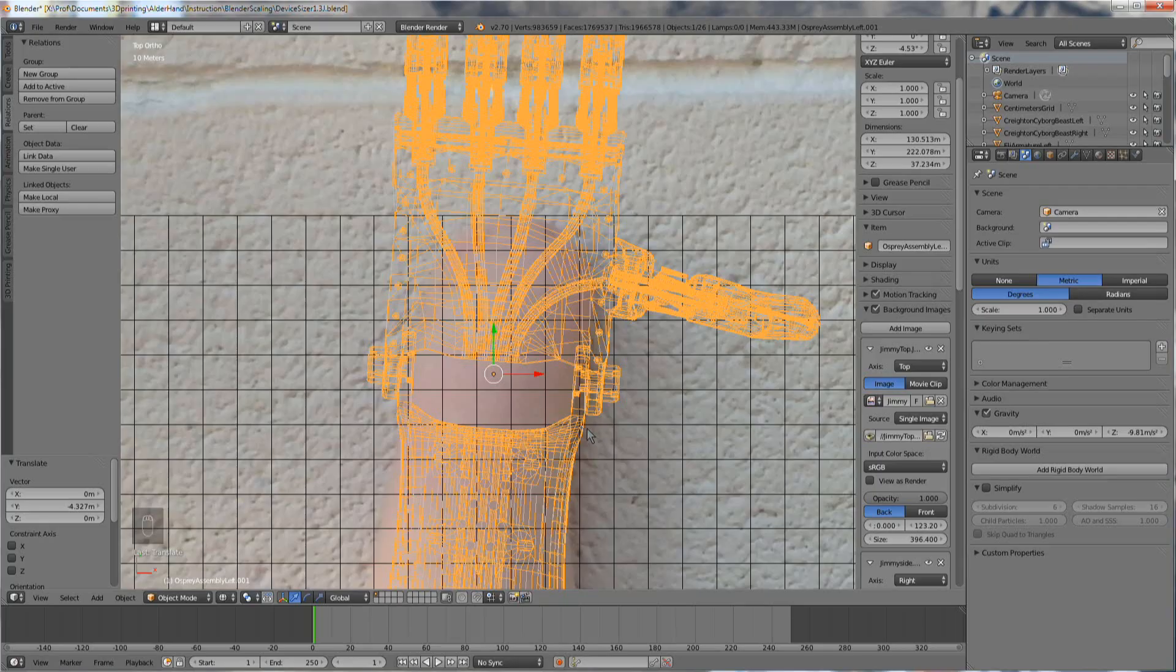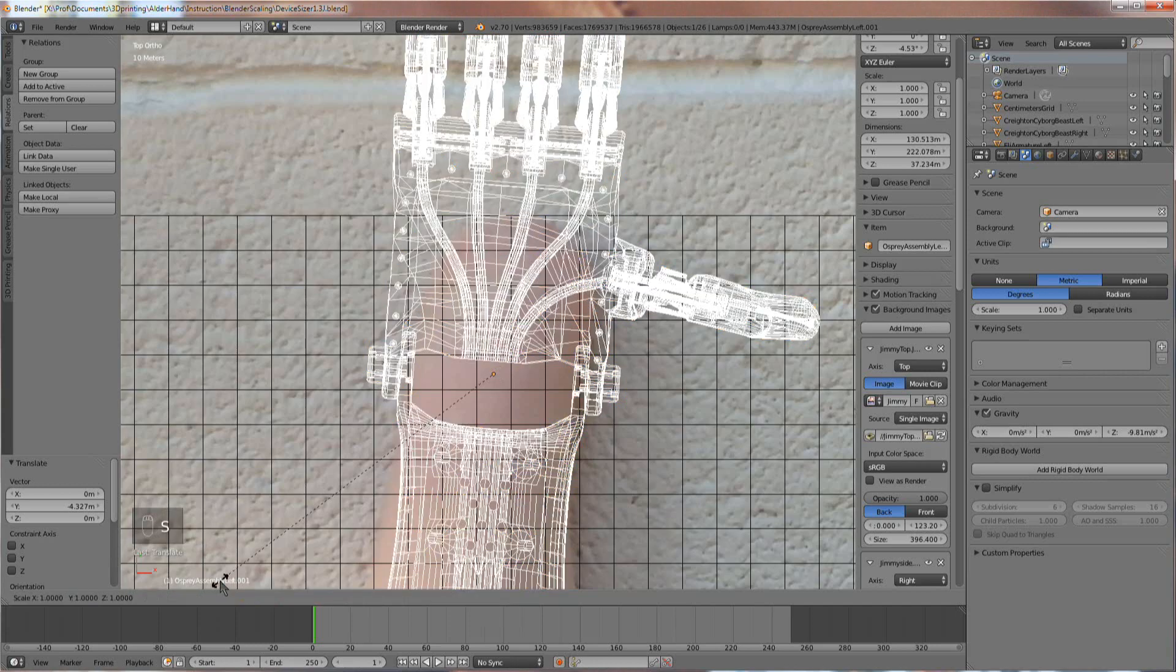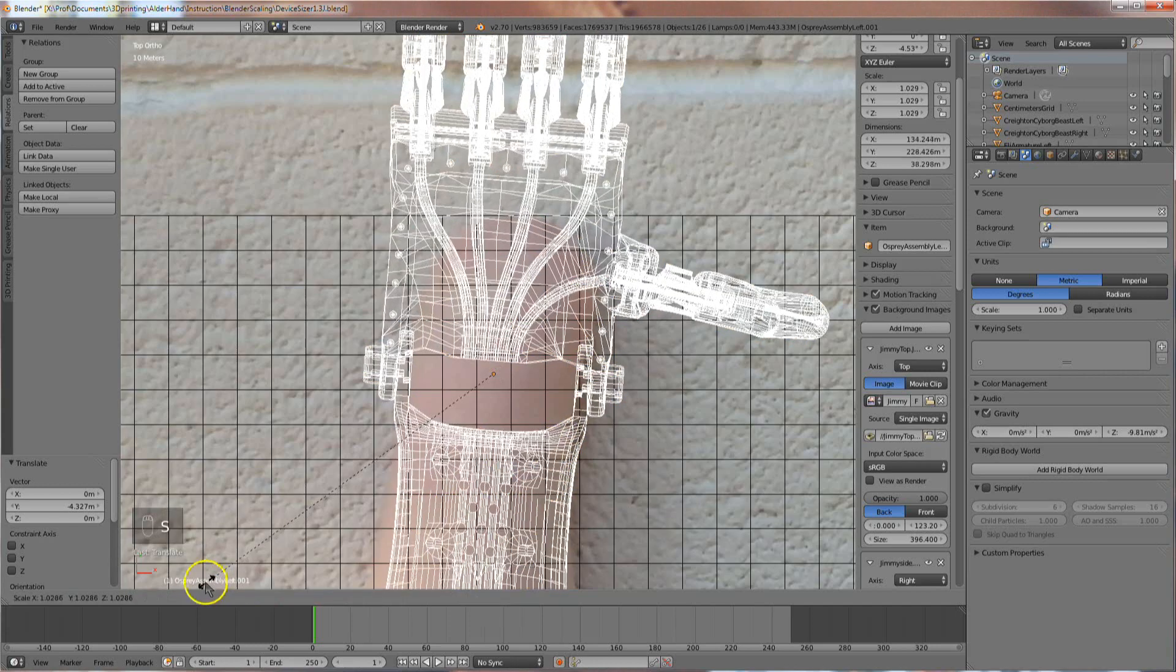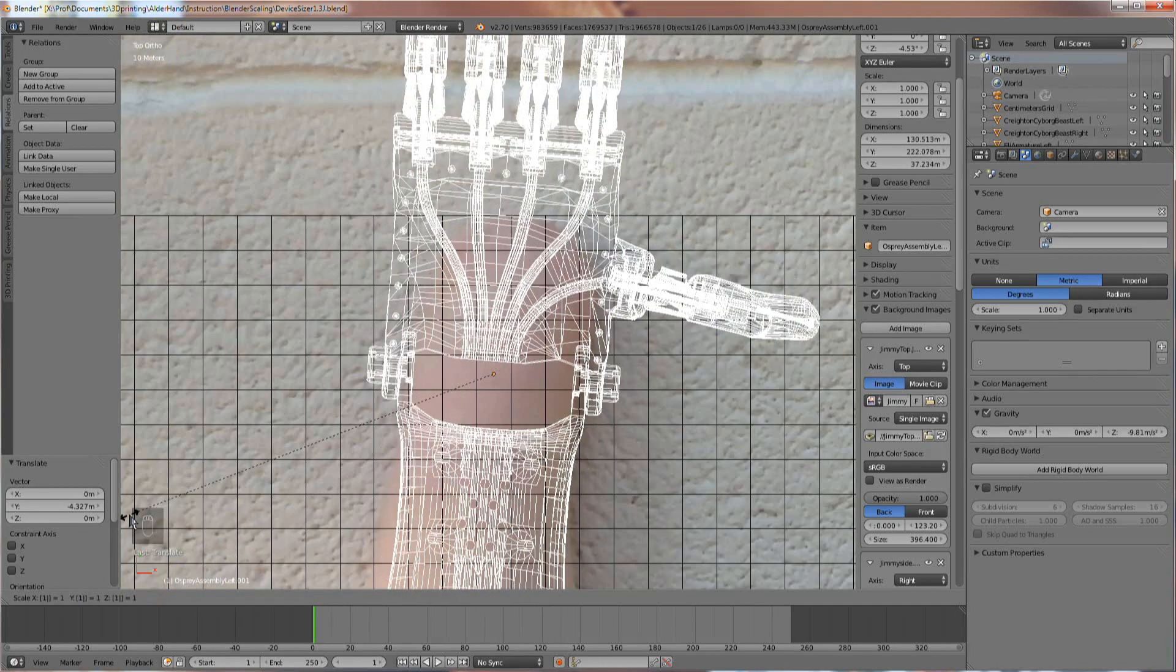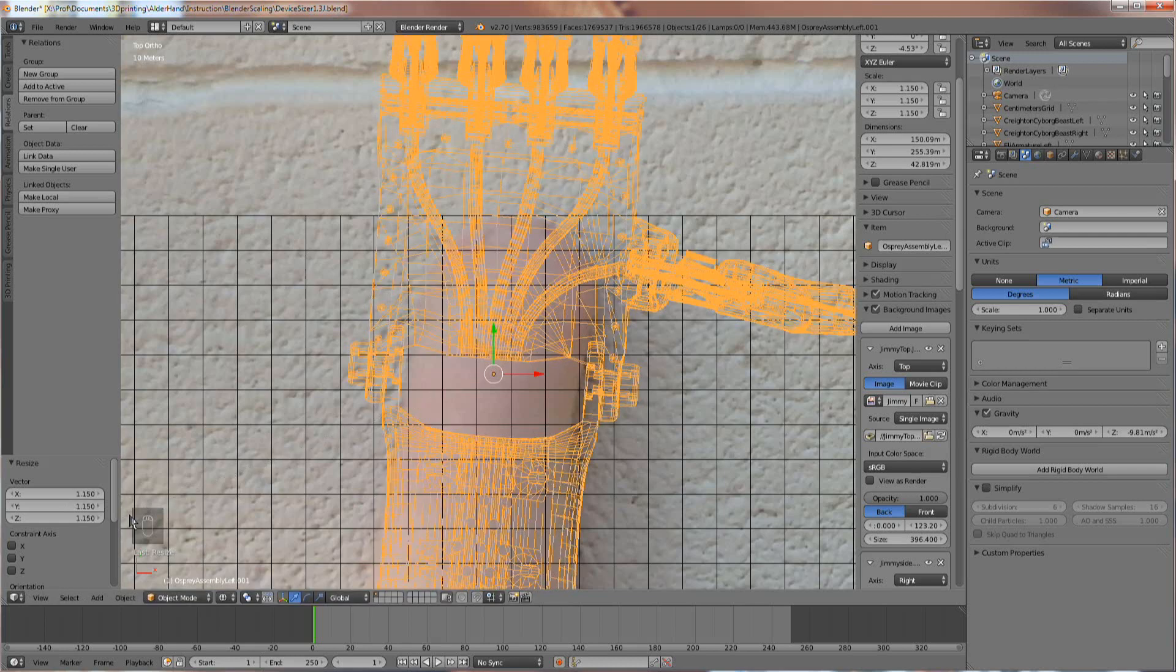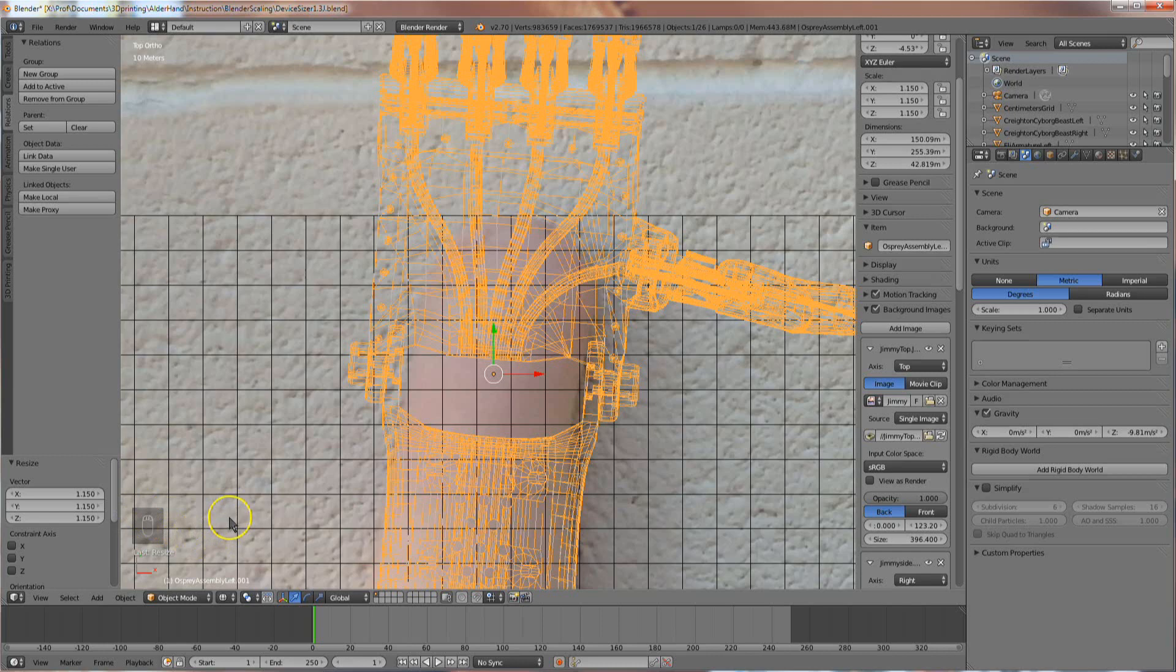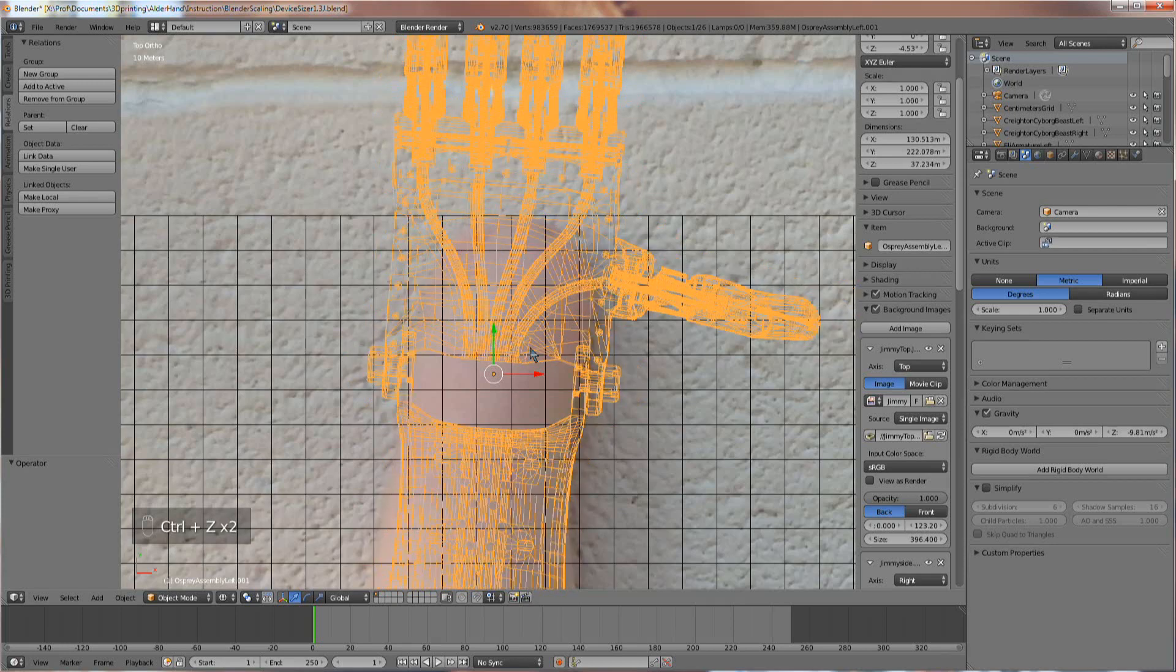I'm going to hit S to change the scale of the device. When I do, look in the lower left of the view window. A field showing the scale factor will appear. When the scale looks right, round off the number and type it in on your keyboard. Then hit Enter or left-click to commit. So basically, I hit S and typed in 1.15 and then Enter. You can undo any grab, rotate, or scale operation with Ctrl-Z.